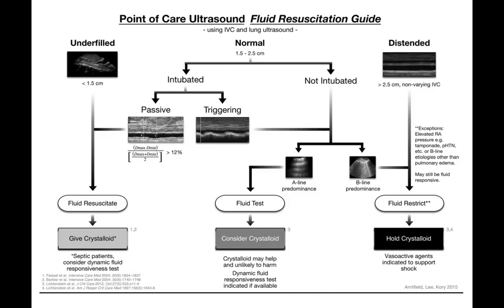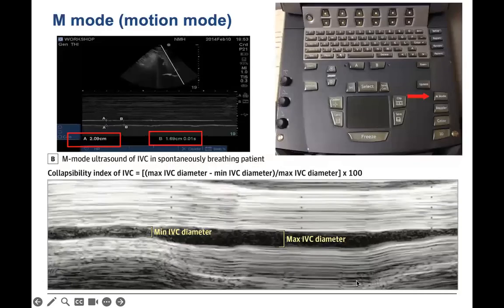That doesn't mean I need to hold my fluid. But then again, if they have A lines, we're going to just fluid test. Maybe we're going to give them some fluid and see how they do. And if they have B lines, then maybe we're going to consider holding.